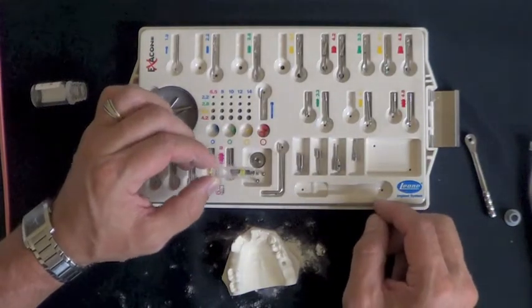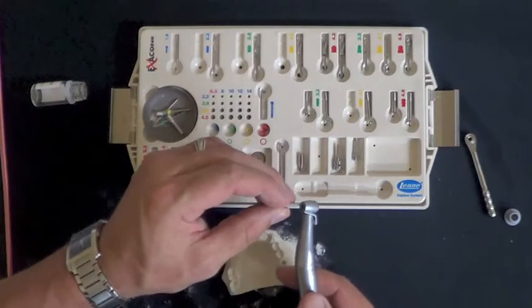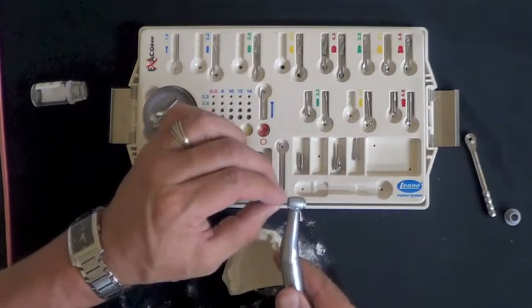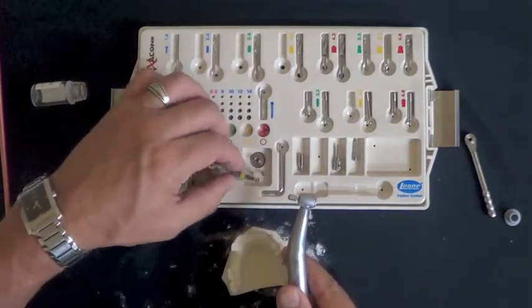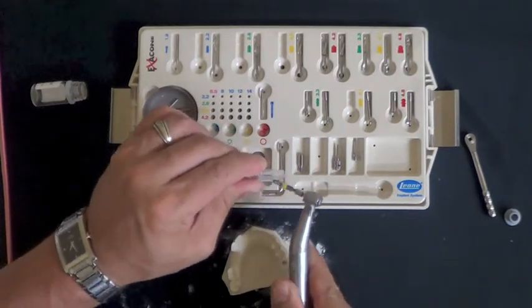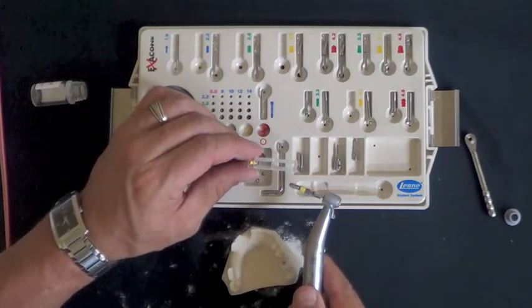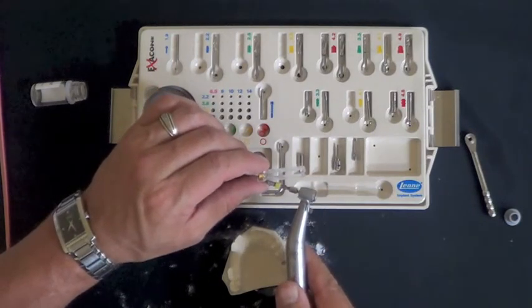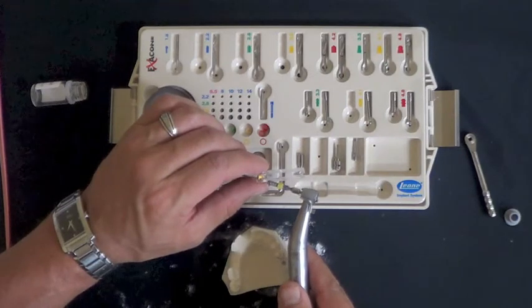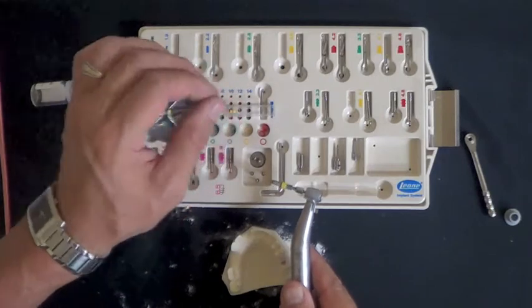Another option is to use the handpiece, which is the one I prefer. Put on your handpiece adapter, attach your implant to the handpiece adapter, and rotate it out of the carrier. You'll also notice on this carrier the cover screw is attached as well. So if you're going to do a second stage surgery, this cover screw will be placed after the implant is seated.